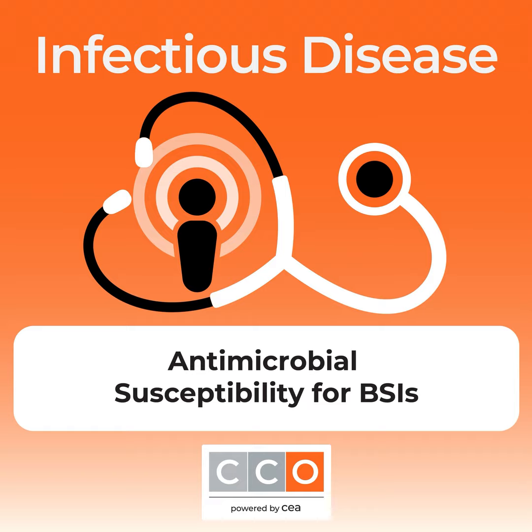Take the E. coli, no gene detected. So to be able to use all those criteria, it's important for the facility to have very well-defined cumulative antimicrobial data. So if you can use those genes, how does an E. coli that is ESBL compare with an E. coli that is not ESBL? How does that E. coli compare with an E. coli KPC, for example? Defining those antimicrobial resistance profiles can help the antimicrobial stewardship team escalate or de-escalate based on the presence or absence of those genes.